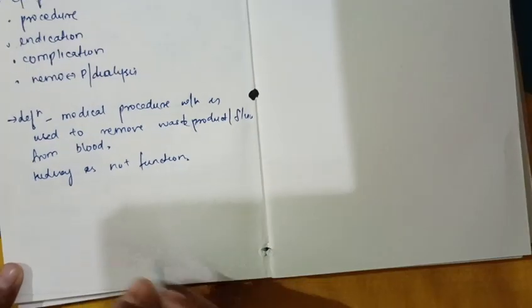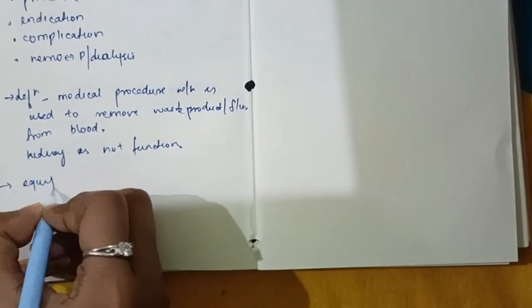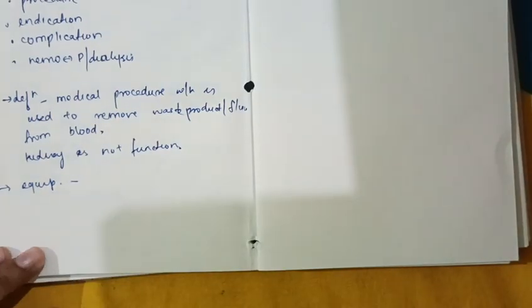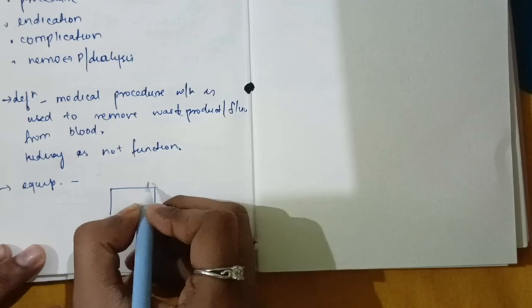Now the equipment used in hemodialysis: first, a dialyzer.